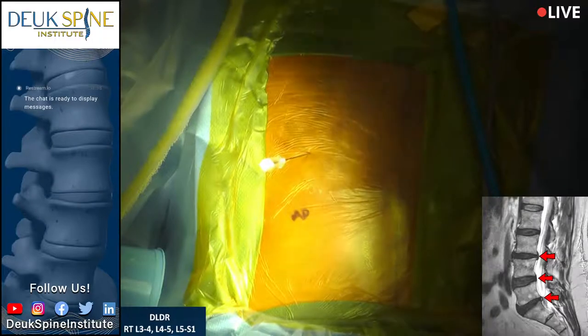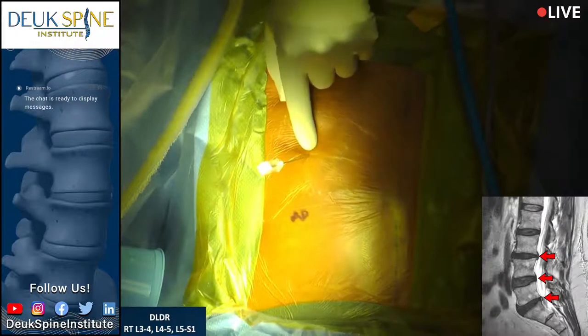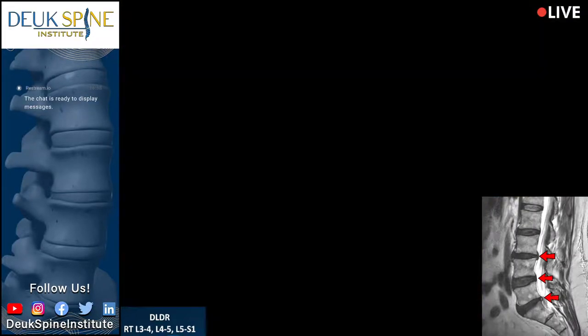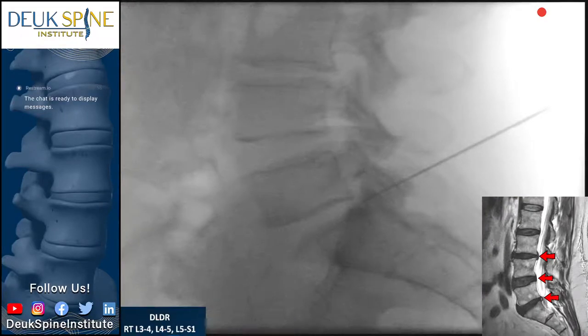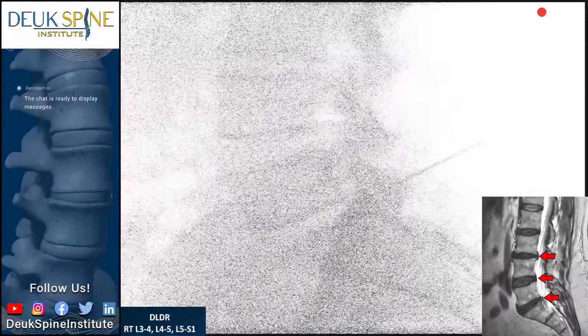Those are the things down here. With the laser surgery that we're performing, the only damage we're doing to this patient's body is the cut we're about to make in the skin. All right, AP. So that little 7 millimeter cut is the only damage this patient will have. Other than that, we're going to be spreading the other tissues apart gently, and we're going to enter the disc right where the tear and herniation are. And by entering the disc where the tear and herniation are, we're not doing any damage to the other parts of the disc. We're going in right where the problem is.